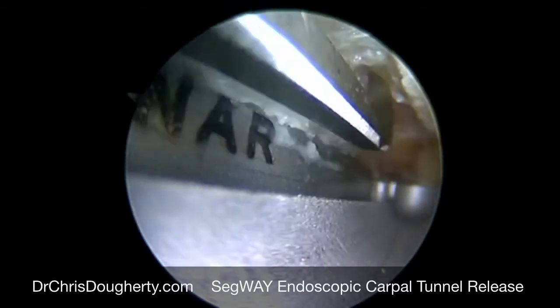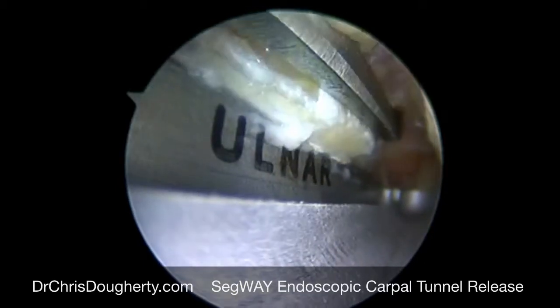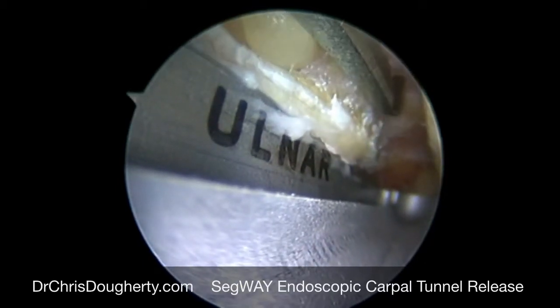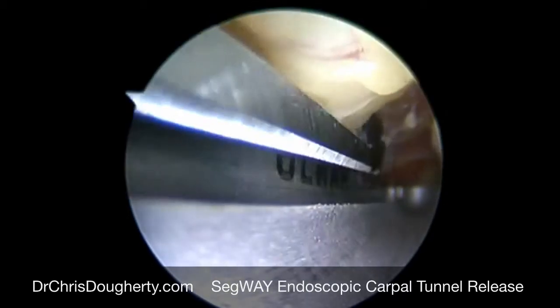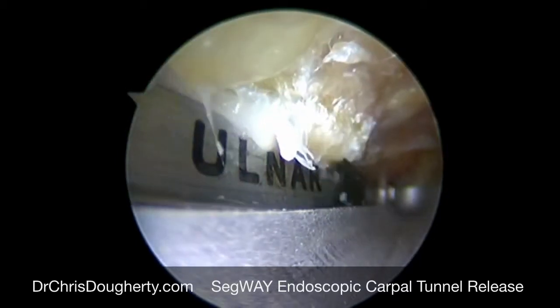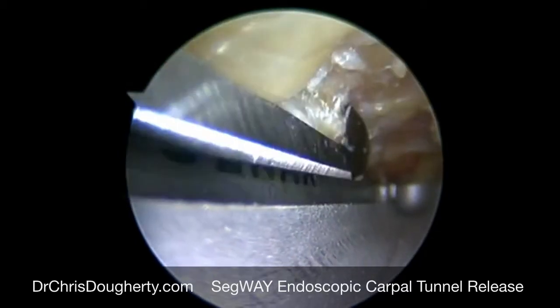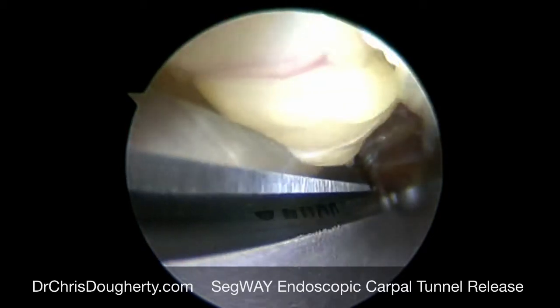Doing the surgery this way instead of a standard open incision typically causes significantly less pain and allows the patient to return to activity with a very small incision above the wrist, without a large incision directly through the wrist, and allows return to normal activity as quickly as possible.